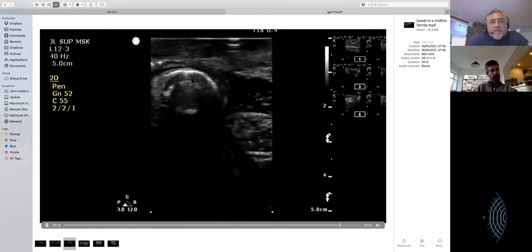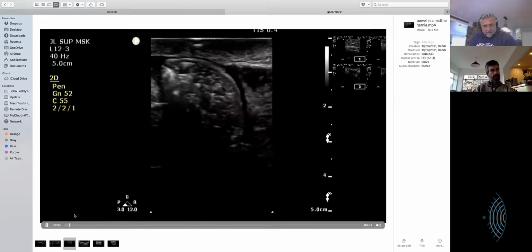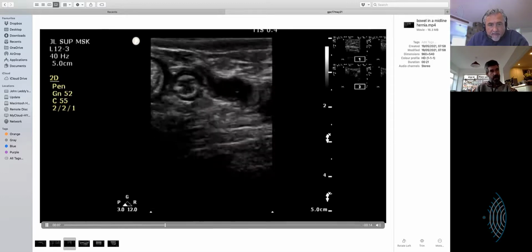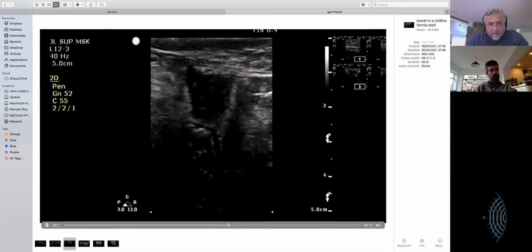And you see there the bright line, it will be air, and the slightly less bright appearance is poo. Where you don't get the dark shadow, that will be air. That's the muscle wall, the mucosa, and there's some fluid going around inside the bowels.